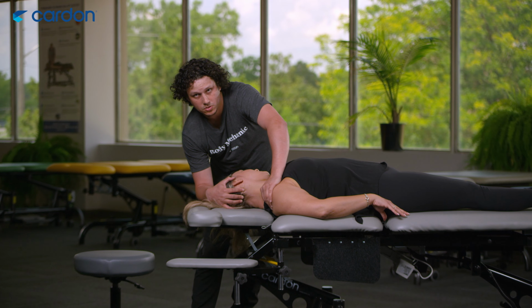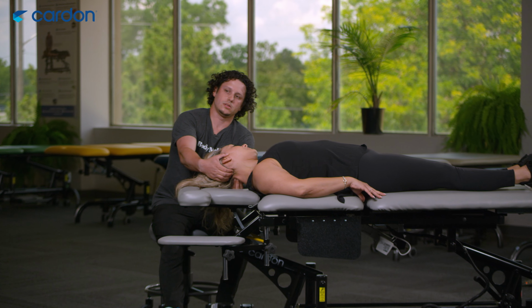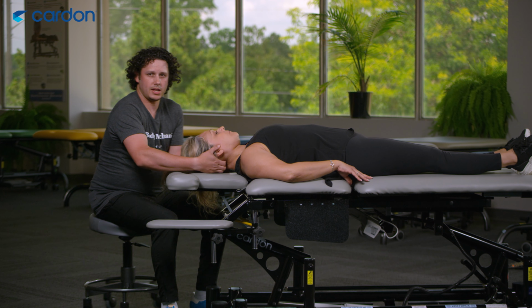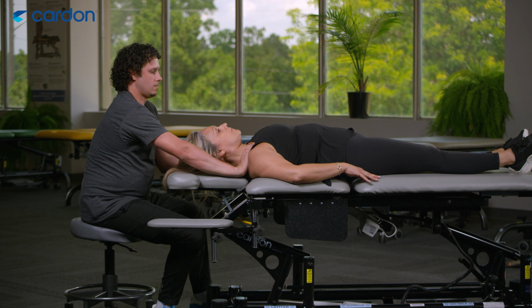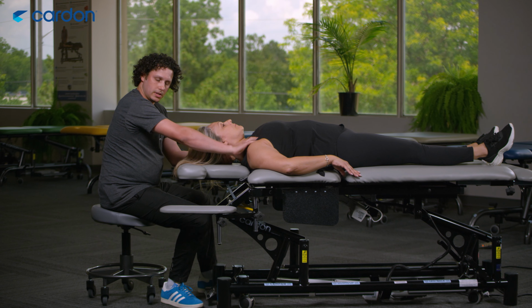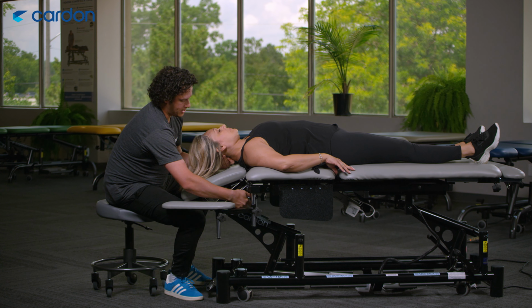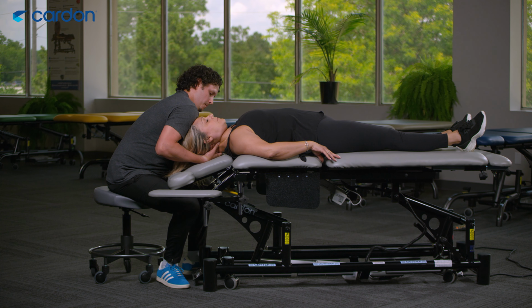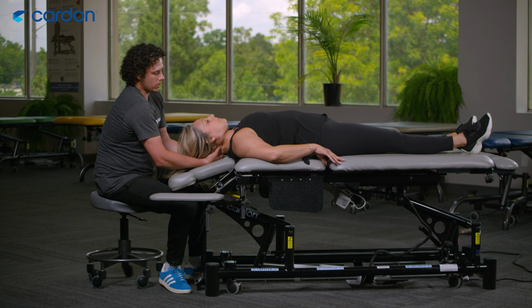Again, you can see the headrest is doing most of the work. I'm using the stool again, and I can come in and nicely stretch out the cervical area. Again, this is getting rid of any headaches, migraines, neck compressions. Trying to get any of those knots out of the shoulders very easily with it. And then if I feel more comfortable with it, I can drop it down even further and pull all the tissues down towards the floor, so we can get that posture back into the person that we're working on.